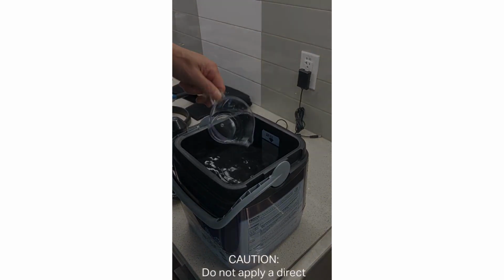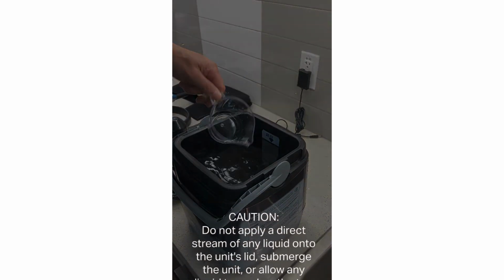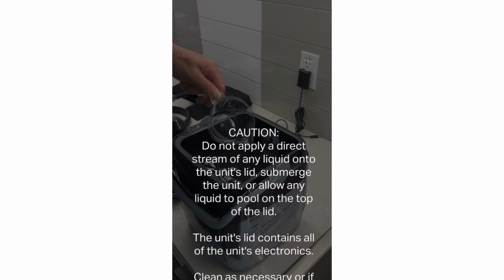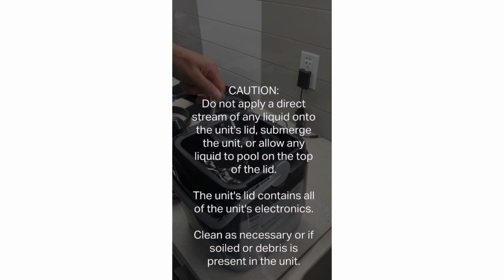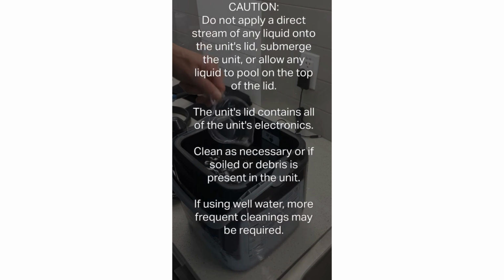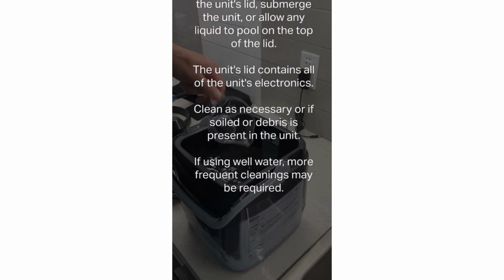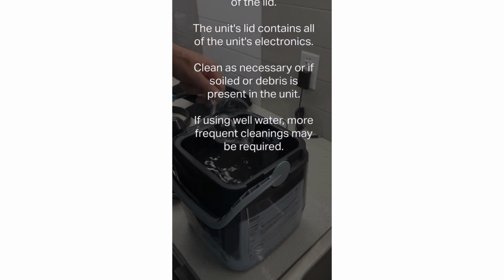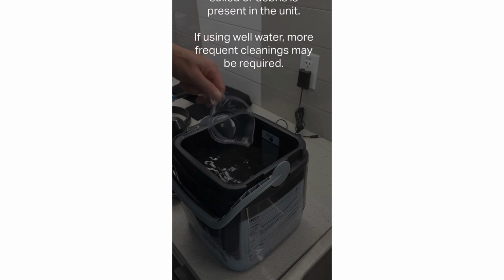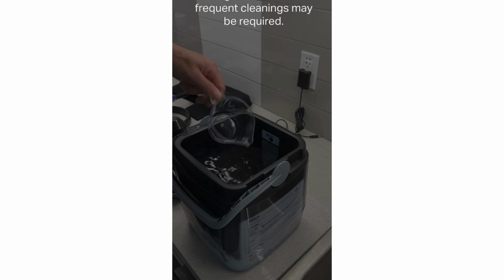Caution: do not apply direct stream of any liquid onto the unit's lid, submerge the unit, or allow any liquid to pool on top of the lid. The unit's lid contains all of the unit's electronics. Clean as necessary, or if soiled or debris is present in the unit. If using well water, more frequent cleanings may be required.